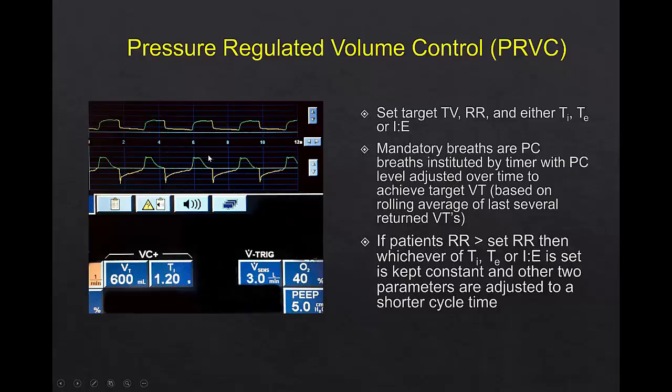Now, what's the beauty of this is the patient's going to get the tidal volume that was asked for, but the machine's going to allow any flow pattern. And I don't know if you remembered, but when I showed you the SIMV-AC before, I showed you a nasty curve that was sucking wind deep in. But here, the patient gets whatever flow is required. So I'll show you.